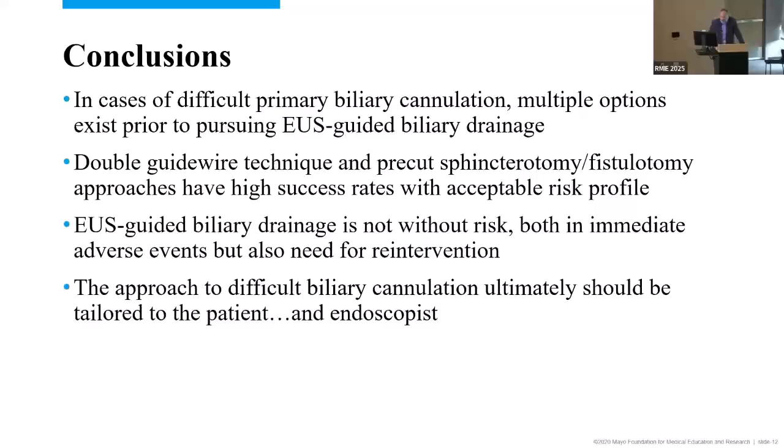We've demonstrated that EUS approaches are not without risk, both in immediate adverse events and the need for reintervention. And I would finally say that the approach to this situation of difficult biliary cannulation ultimately should be tailored to the patient, but also the endoscopist. What's your comfort level? Where are you going to have greater success in helping this patient? And that really should kind of take center stage in this discussion. Thank you.